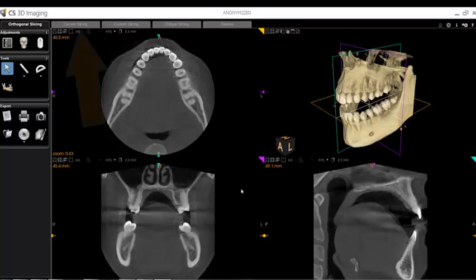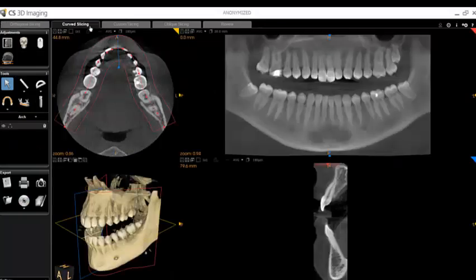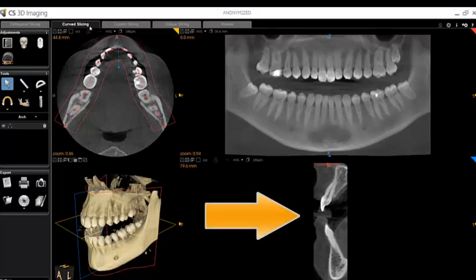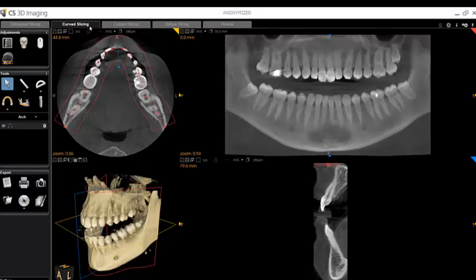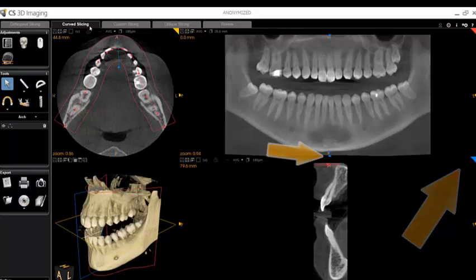Another useful viewing option is the Curved Slicing tool. Simply click the tab to access this view. Curved slicing allows for visualization of the patient's scan at any point along a panoramic curve. Along with the panoramic image, the other image that appears is a transaxial cross-sectional view. Please note the blue tab in the corner of this image, which corresponds to the blue movement handle.